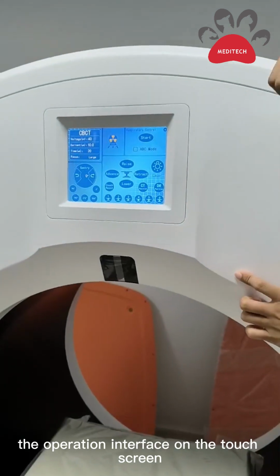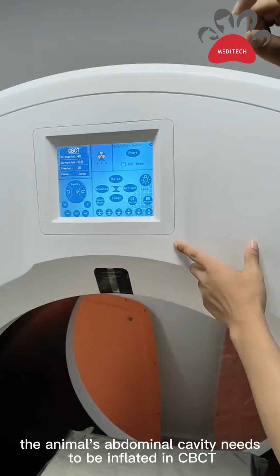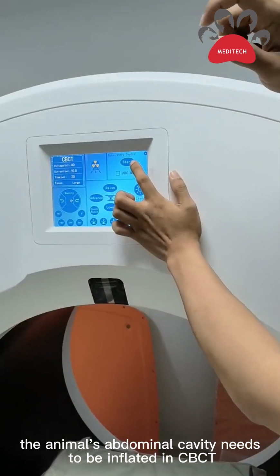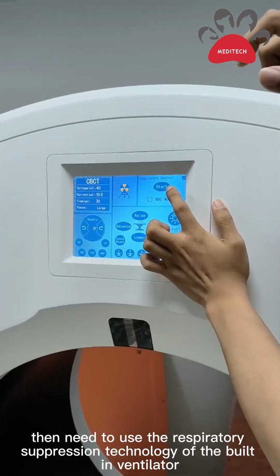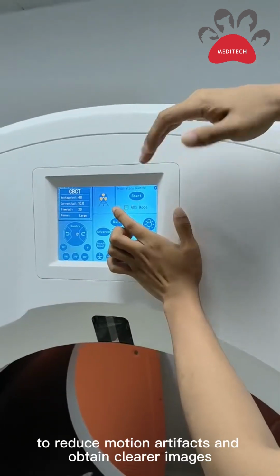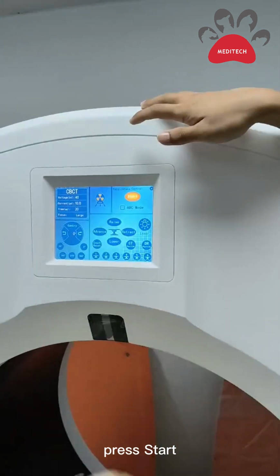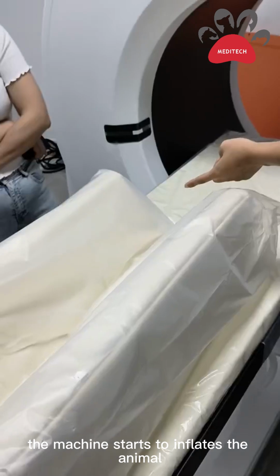The operation interface on the touch screen. The animal's abdominal cavity needs to be inflated in CBCT. Then we need to use the respiratory suppression technology, the built-in ventilator, to reduce motion artifacts and obtain clearer images. Press Start. The machine starts to inflate the animal.